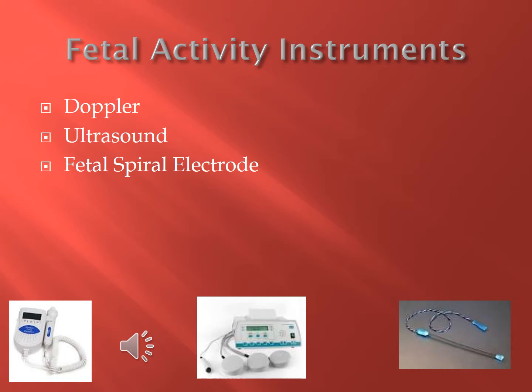The Doppler converts myocardial movement into sound. The ultrasound should be placed over the fetal back. Use Leopold's maneuvers to determine fetal position. It detects fetal heart rate baseline, variability, accelerations, and decelerations. It also provides a permanent tracing of the recording.